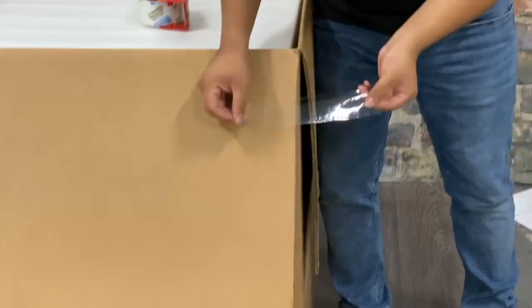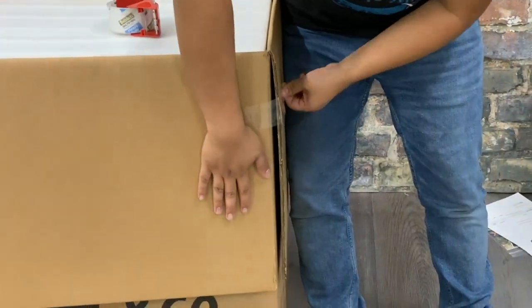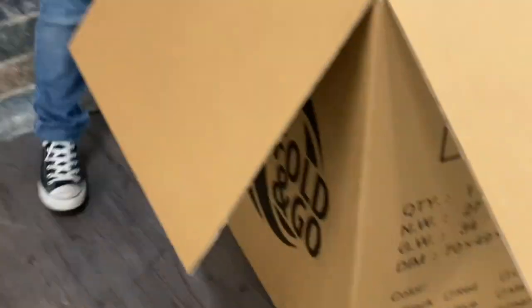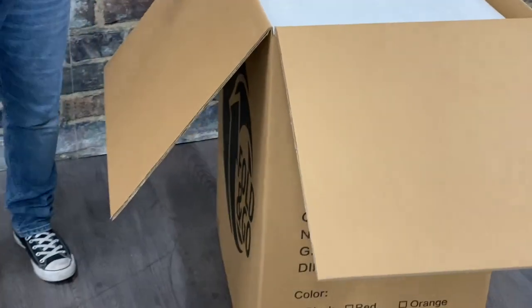The first tip is: once you open it, tape down the opposite corners. This is going to keep the flaps from flapping up and getting in your way as you rotate the chair to get it out of the box.